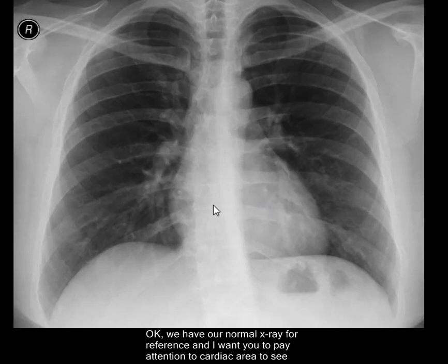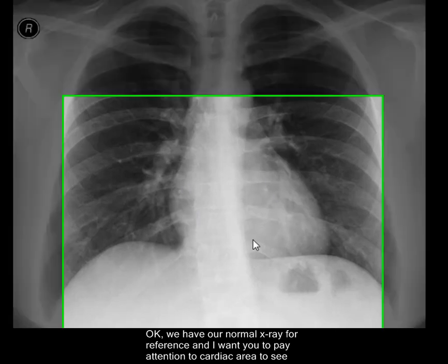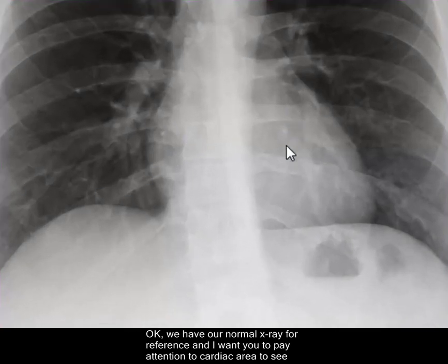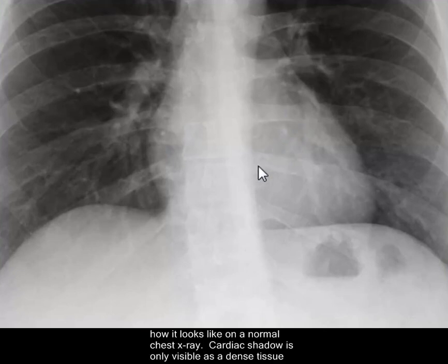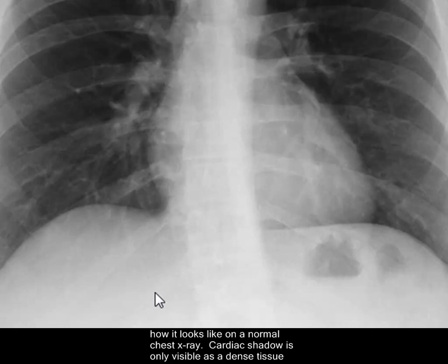We have our normal chest X-ray for reference, and I want you to pay attention to the cardiac area, just to see how it looks on a normal chest X-ray.